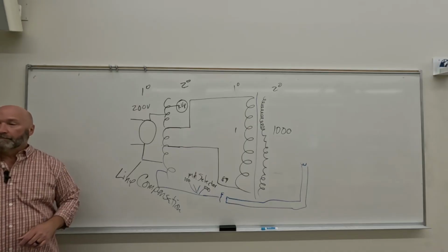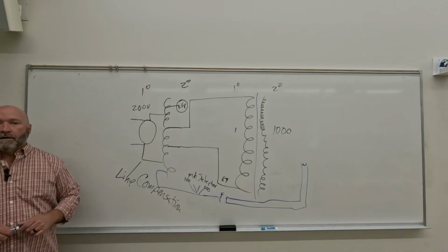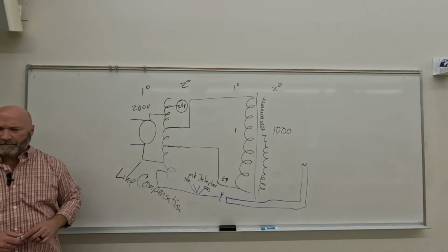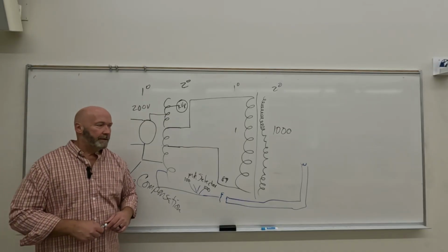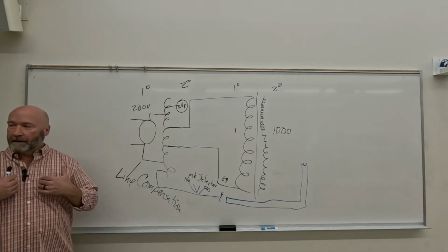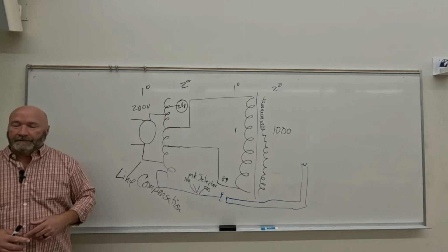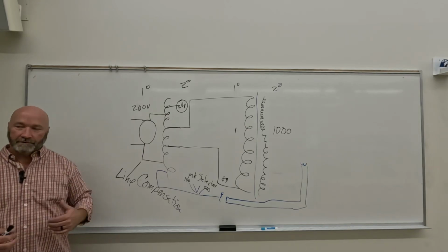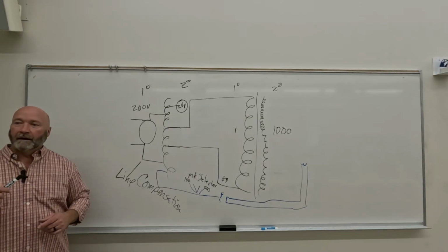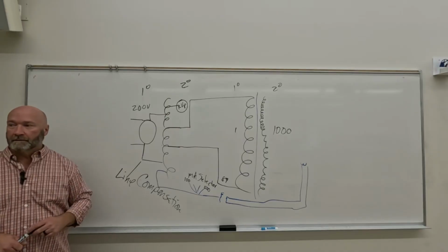But sometimes we need motion to blur out other things, okay? Like, and we're going to get into this, end of the semester and next semester, one or two, whenever we're doing T-spines. When we do AP of the T-spine, everything's good. Got the mediastinum, and it's all fluid filled, right? So it's looking kind of like the L-spine. But whenever we do lateral, our T-spine is going to be superimposed not just by ribs, but two lungs.